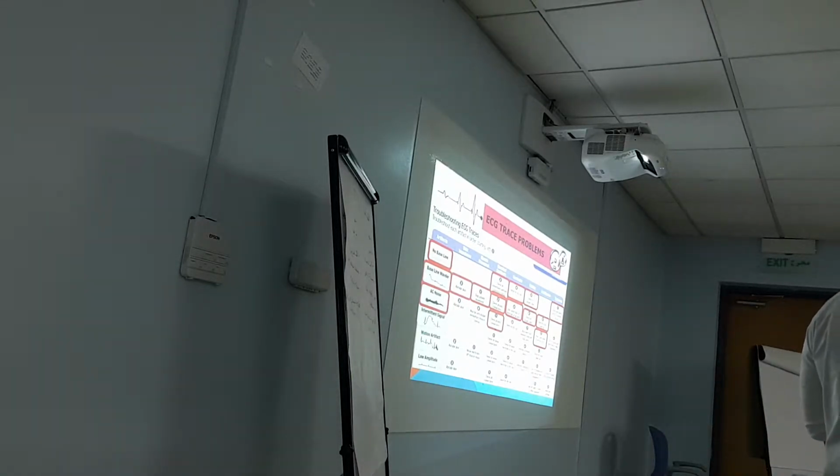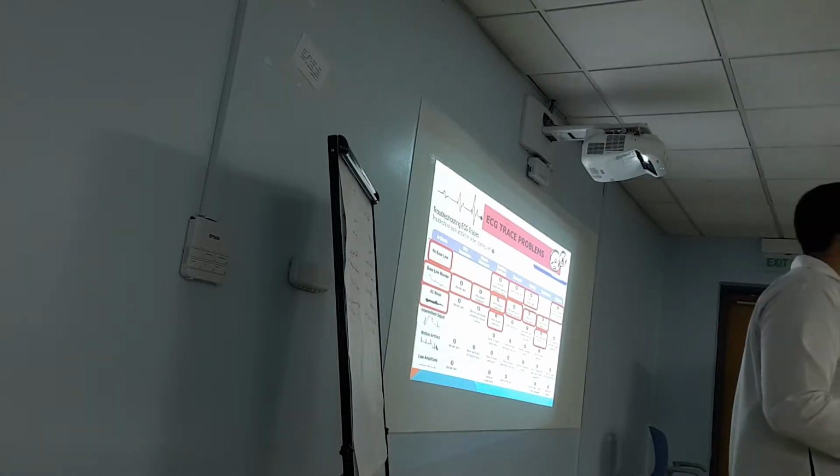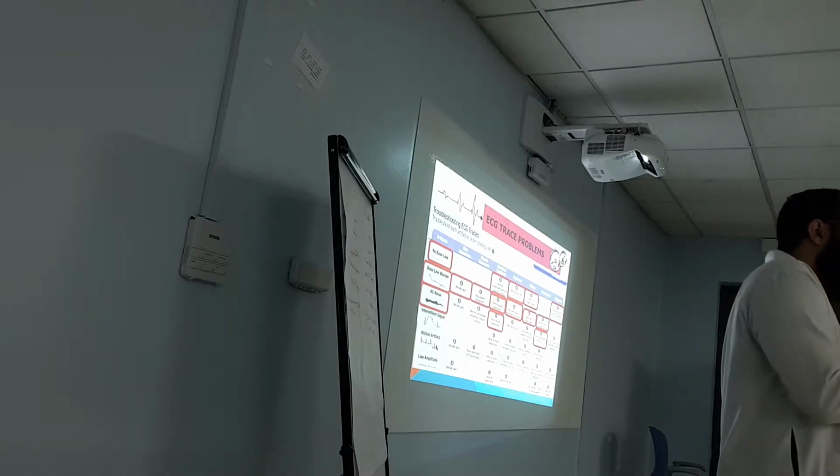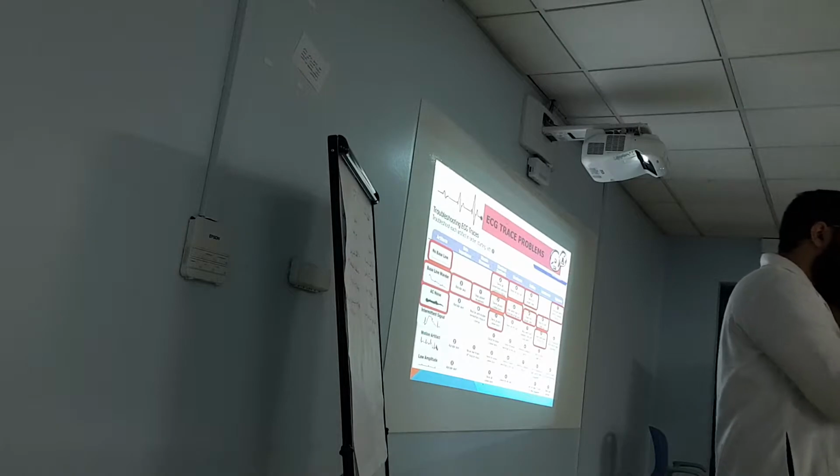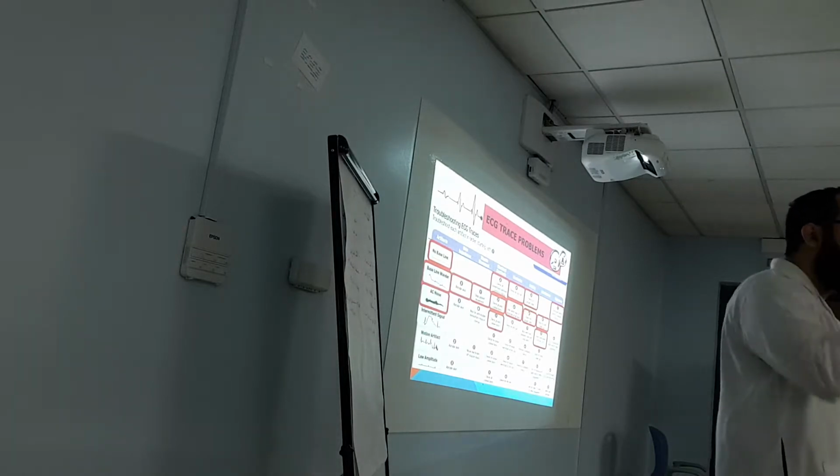Let's say the ECG cables are beside other AC electricity cords. Each cable carrying electricity produces a magnetic field around the cable. Probably the cable is not properly shielded, so the magnetic field will affect the ECG cable itself. So make the ECG cable isolated from other cables, not beside each other. Keep other cables away from the ECG cable.